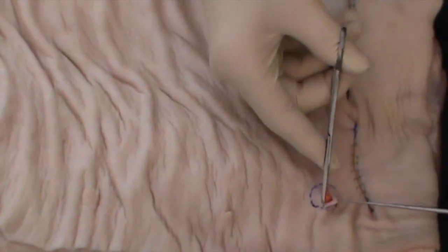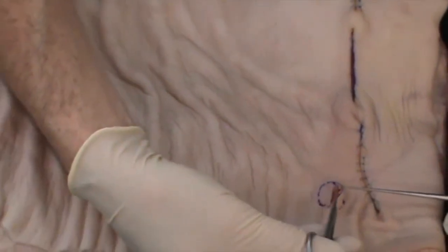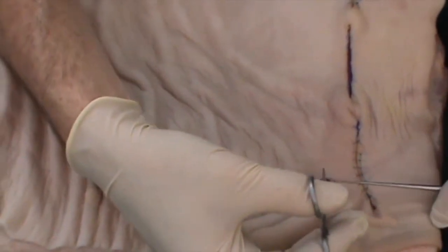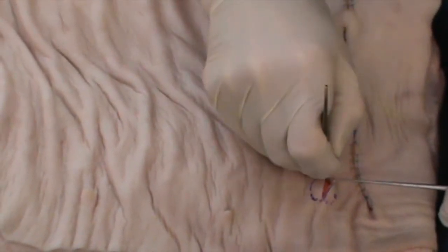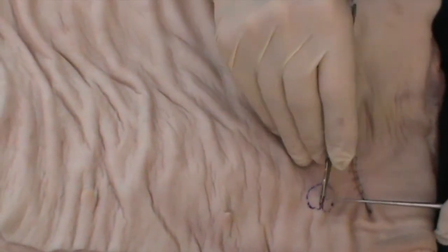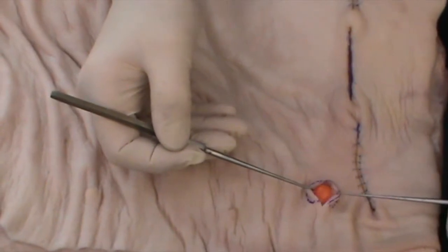It's a mistake to have too small an incision. If you think you may have difficulty in getting the cyst out, make the incision a little longer. Better to have a slightly longer incision and a completely removed cyst than a small incision and then the difficulty of removing the remains of a ruptured cyst. So here I'm going to just extend my incision slightly, and you'll be able to see we've now exposed this cyst.